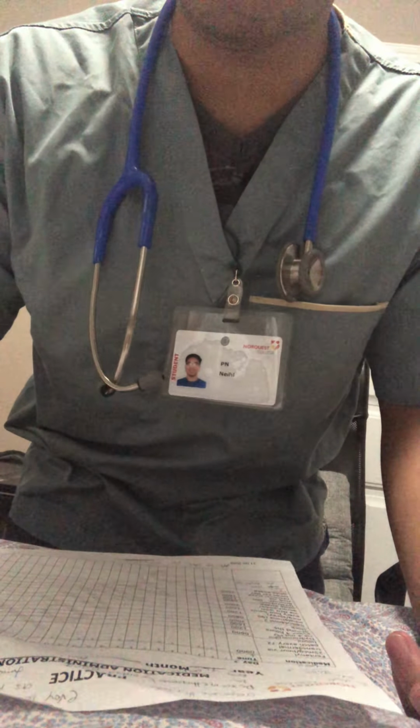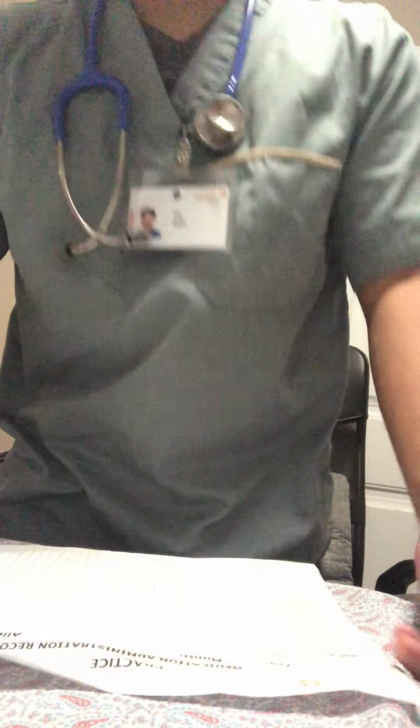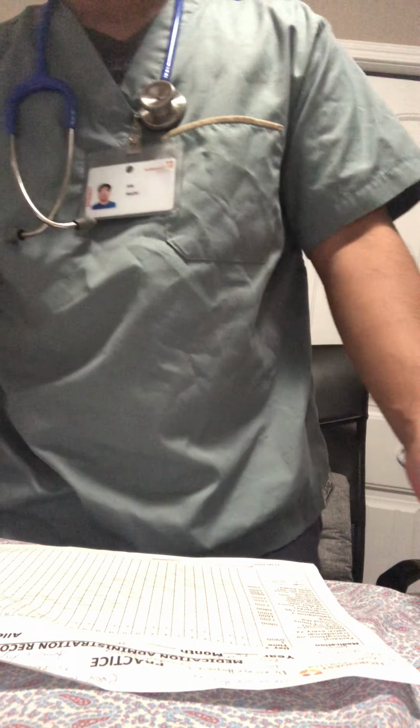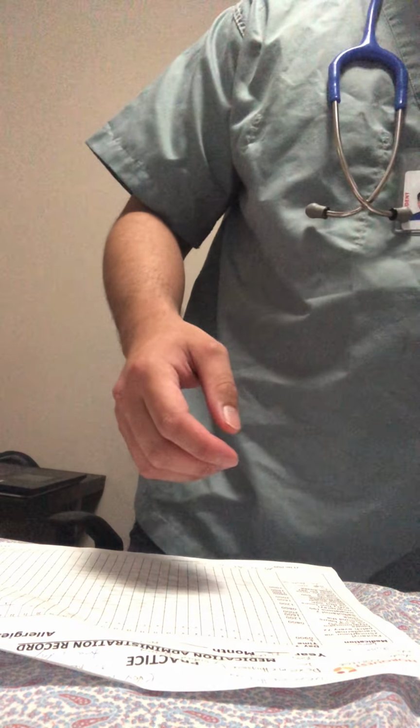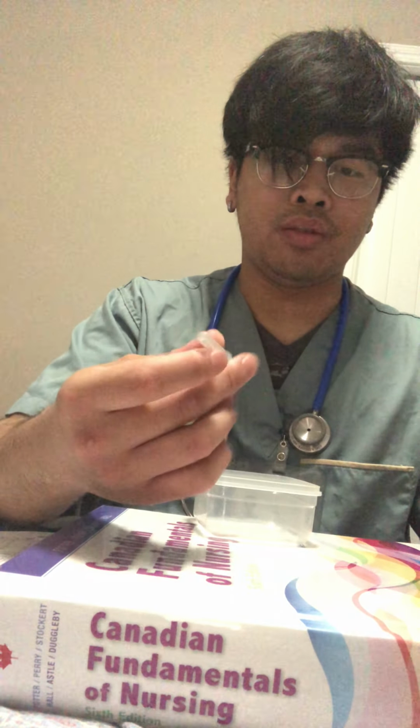Before I move on to my third check, I'll be preparing everything. I'm going to get my tray, apply hand hygiene, and get everything that I need. Here we have a 1 ml syringe, a blunt fill needle, 25 gauge, an alcohol swab, and a vial.